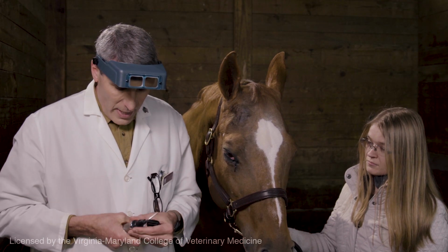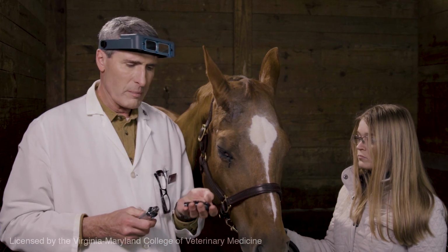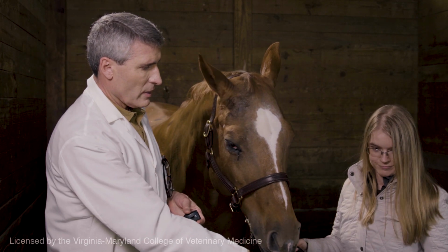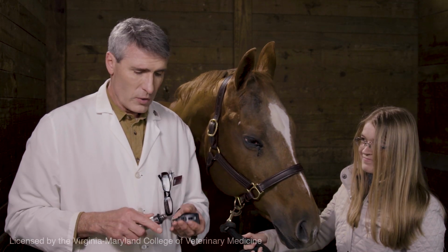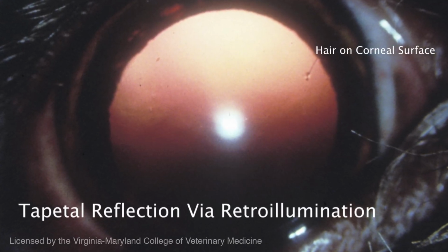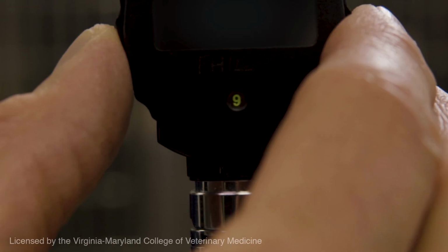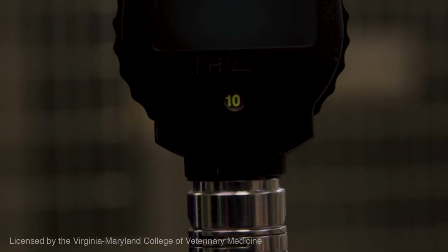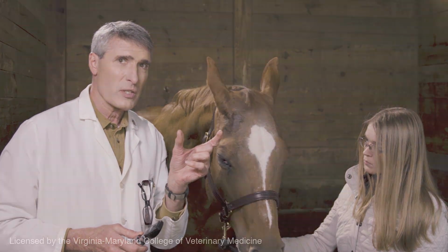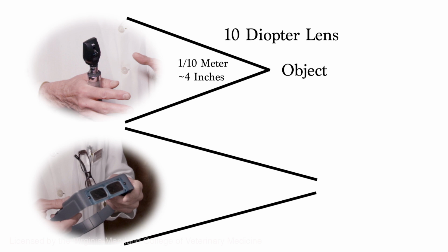Okay, so now let's learn how to utilize our direct ophthalmoscope a little bit more for even closer magnification and closer looking, utilizing what we call retroillumination. The diopter wheel allows you to adjust the different diopters, which allows you to get closer and closer to the patient. A 10-diopter lens will allow a person to focus at 1/10 of a meter, which is about 4 inches, which is double the magnification I got using the optivisor loop on my head.